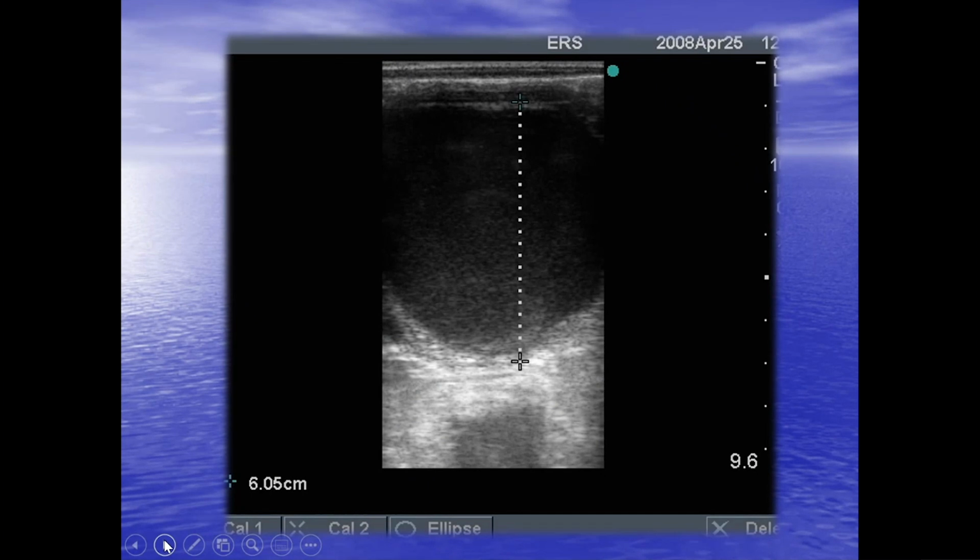Now, I said I'd come back to this. These echogenic particles in the ventral margin of the follicle. Yes, they are a sign the mare is close to ovulation, but they're also a sign of something else. If they become more widespread, therein lies a bit of the problem. What does more widespread mean?